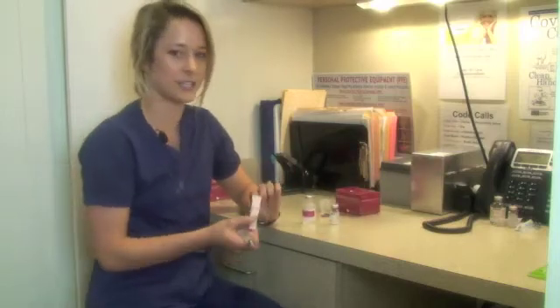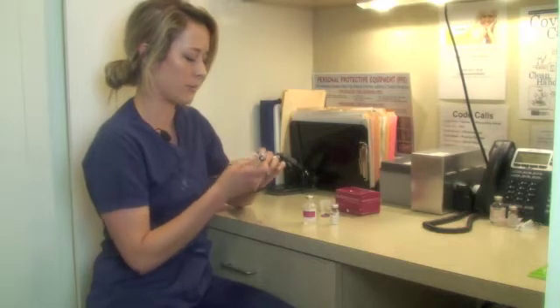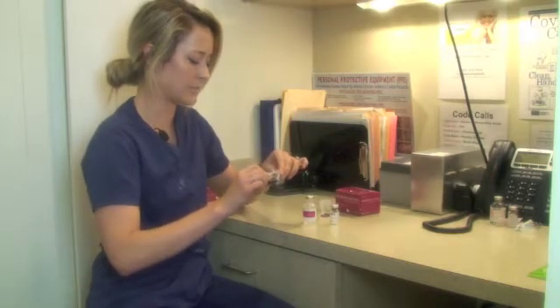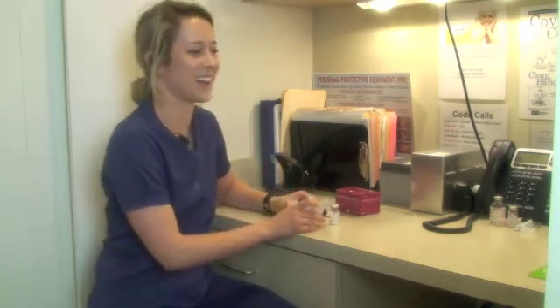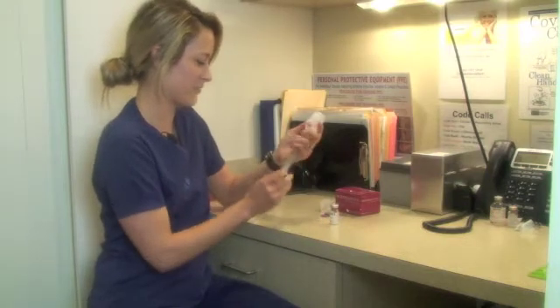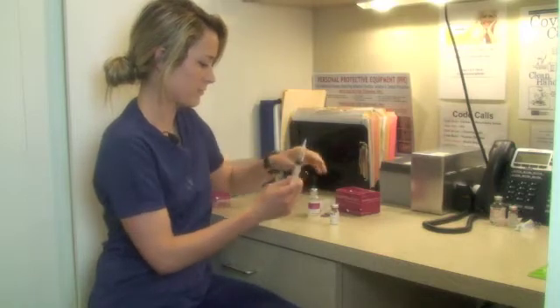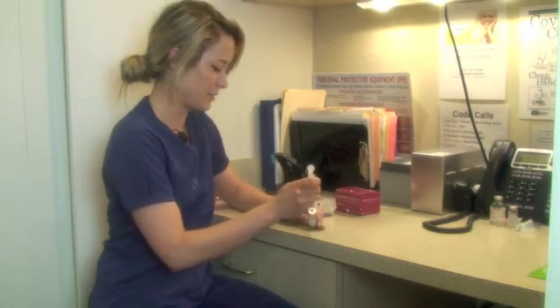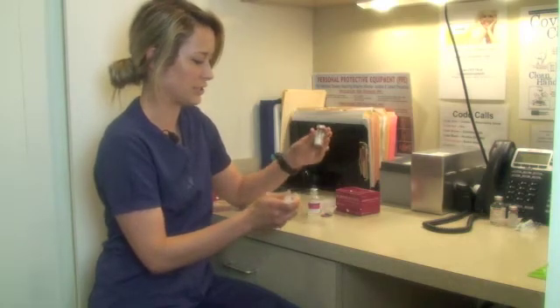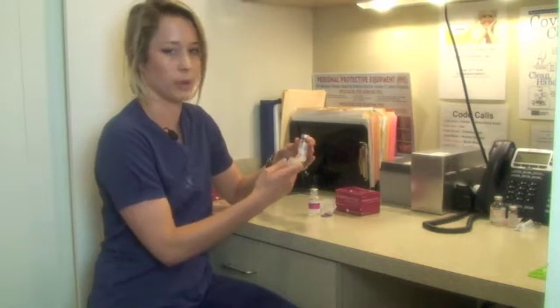We're using an 18 gauge needle to pull up the sterile water, and we're going to pull up five cc's of sterile water. And then you just take the syringe and you inject it slowly into the Sculptra.